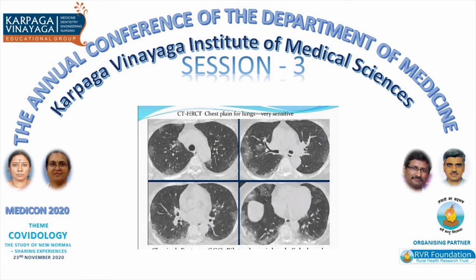So this is an HRCT chest in a case of COVID, and these changes are very classical. You can see the subpleural changes. If this is normal, these are the subpleural ground glass changes. You can see it is bilateral. These are called ground glass opacities, GGOs, and they are bilateral, more peripheral and subpleural. So these are very classical changes of COVID.